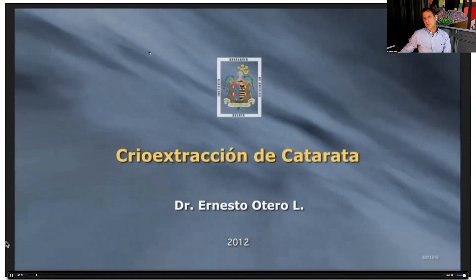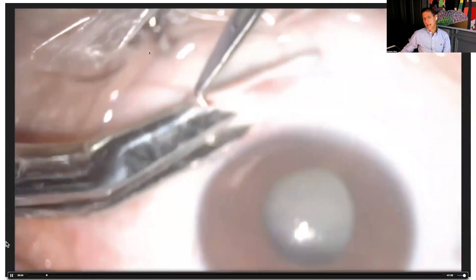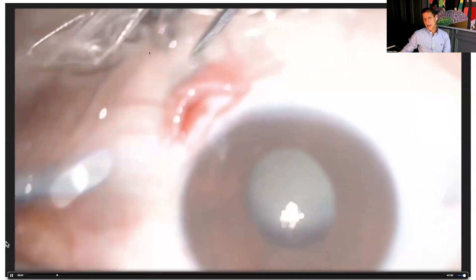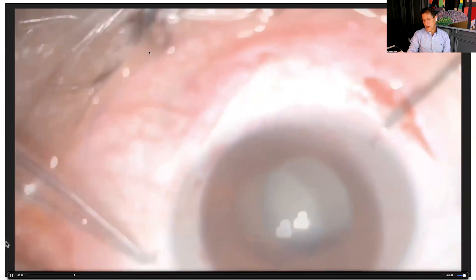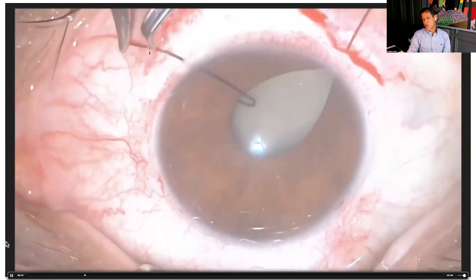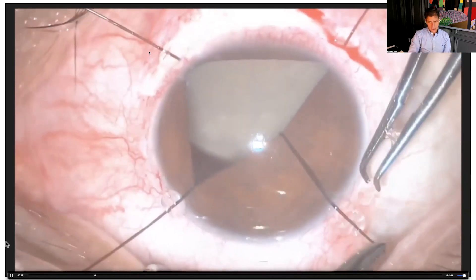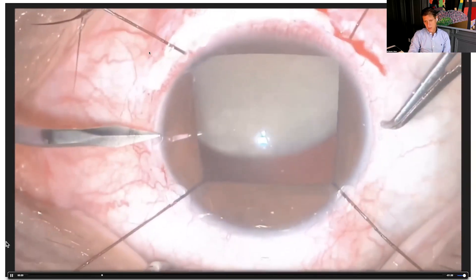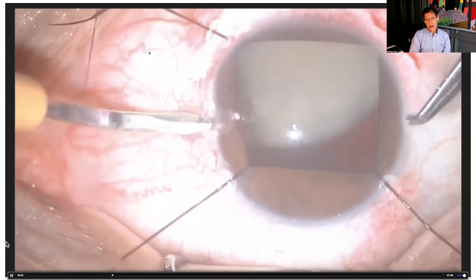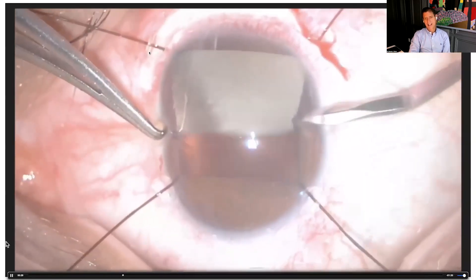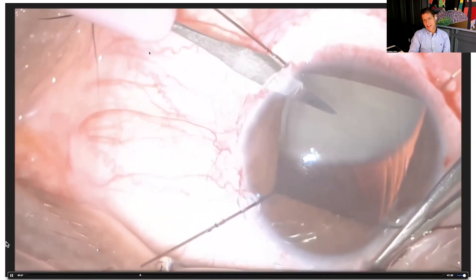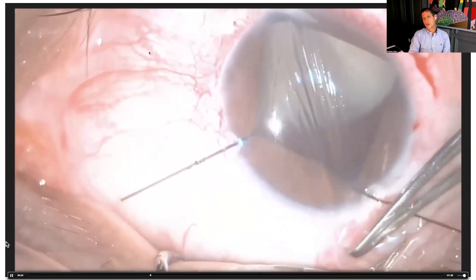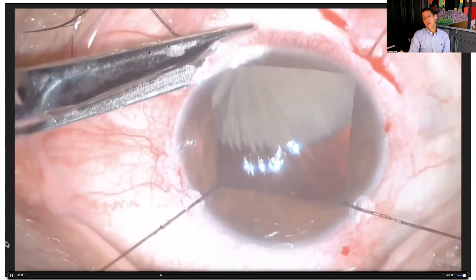For more complex cases — a highly subluxated, very dense cataract in a patient who had prior vitrectomy for retinal detachment — he came from Panama with this dangling cataract in a vitrectomized eye. I decided to perform a cryo-extraction of the cataract.